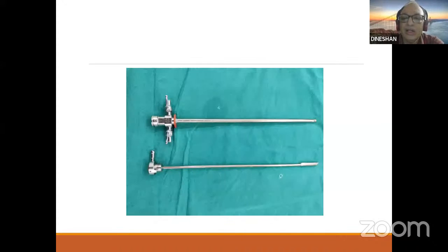For all the other obturators, you have grooves over the dorsal part of the obturator tip, so that it will help the egress of the fluid. And for the 17 French, you have a small opening near the beak, to allow the egress of the fluid. And the beak is always shorter in 17 French, but longer in all other sheaths.